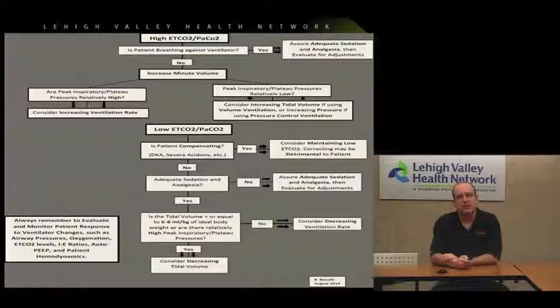So especially if you have a blood gas and a pH that can document a low pH level on a gas, then we probably don't want to correct the low end tidal, at least all the way. If we just suspect, even if we don't have a blood gas, maybe one just wasn't drawn, maybe this is a scene mission, maybe the patient's real shocky, we suspect they're DKA, we suspect they're really acidic, maybe we want to go on the low side for maintaining a lower end tidal.